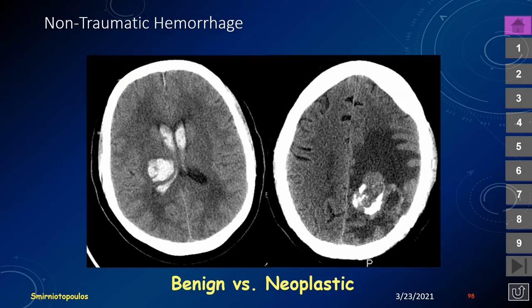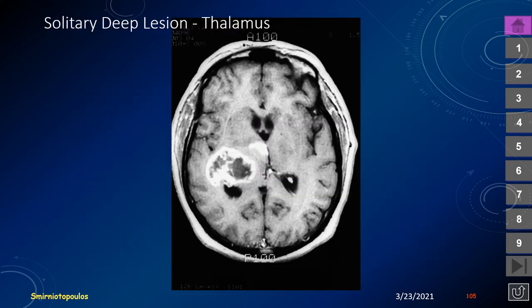In contrast to non-traumatic hemorrhage, which in the first 24 to 48 hours shows only a circumferential halo of altered signal representing extruded serum, a neoplastic hemorrhage tends to be very heterogeneous and may be surrounded by vasogenic edema — as seen in this patient with glioblastoma multiforme. Here is another patient with a solitary deep lesion in the thalamus — an irregular and heterogeneously enhancing ring lesion, also a glioblastoma multiforme.